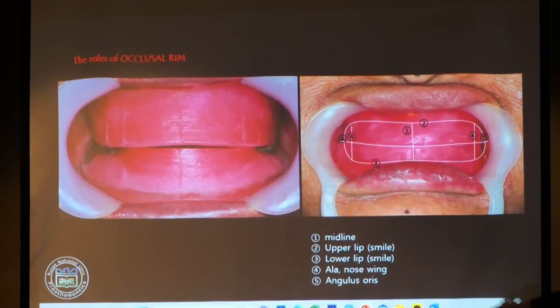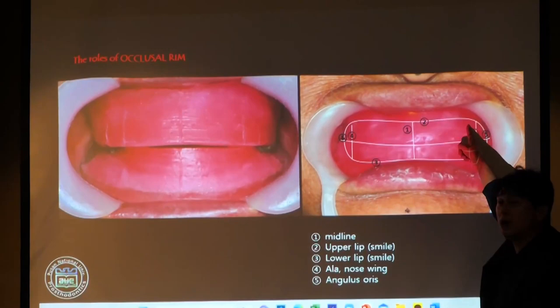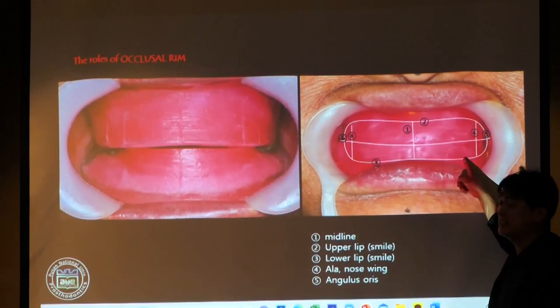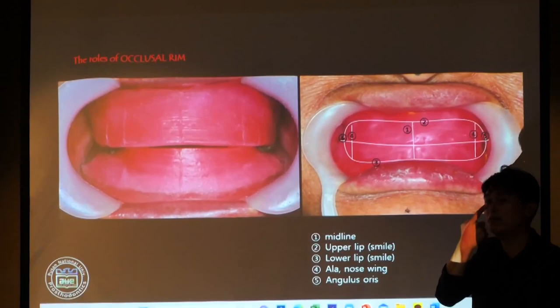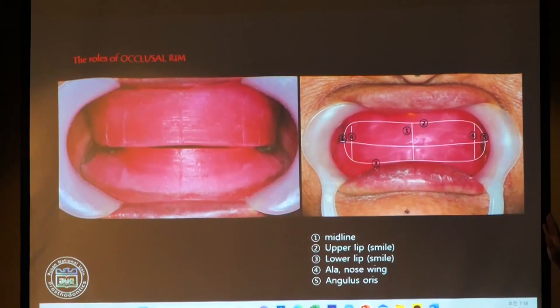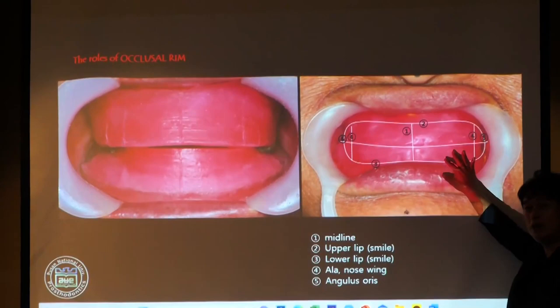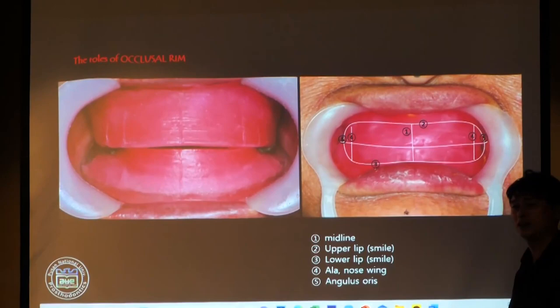Anyway, this is the additional information in the occlusal wax rim. Number one is the midline. Number two is the upper lip when the patient smiles. Third is the lower lip when the patient smiles. Four is the alar line; the alar line indicates the canine location. And five is the angulus oris position. Those things can be given to the dental technician. If you give this information, the dental technician will be happy because they know everything without a patient scanner.